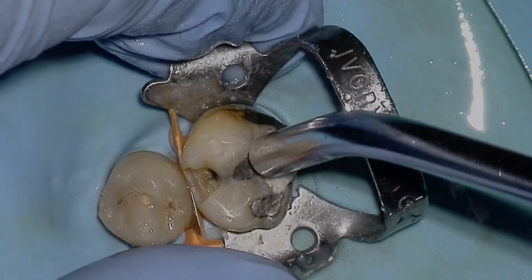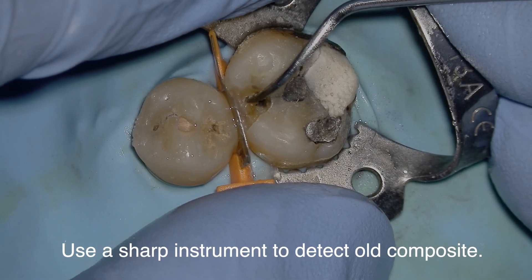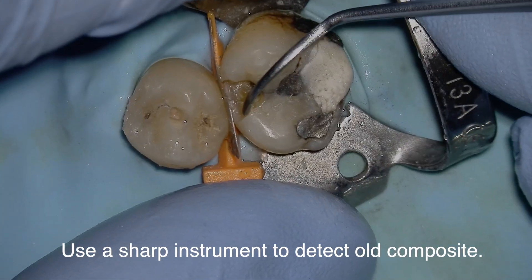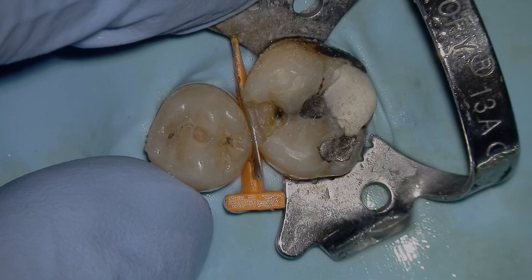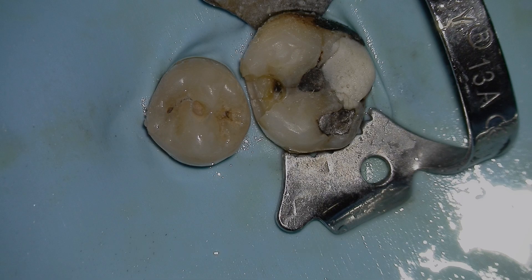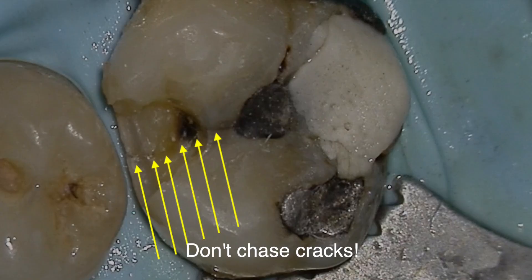Tip number four: use a sharp instrument to scratch old composite — you'll usually get a black line on the old composite that tells you whether it's composite or tooth structure. Tip number five: make sure the gingival contact is broken. There is nothing more frustrating than trying to jam down a sectional matrix or Tofflemire when you haven't broken the gingival part of the contact.